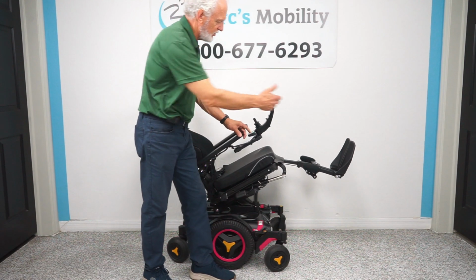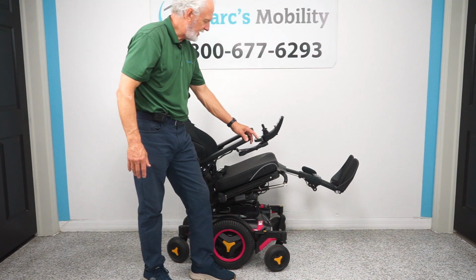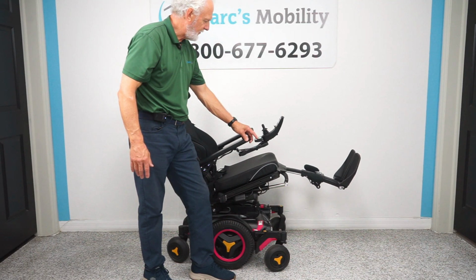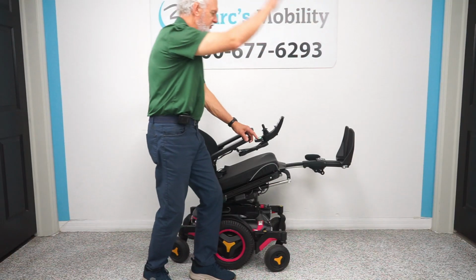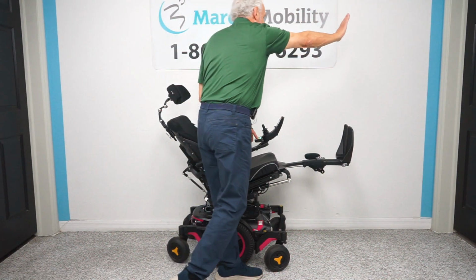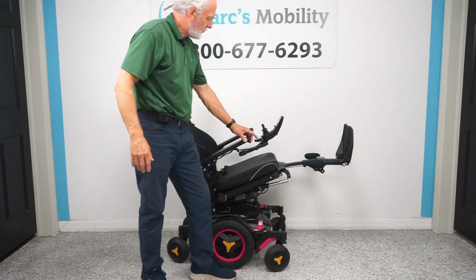Now remember, as I said, we can adjust these feet. So we're going to bring the tilt down, and I think we can get the legs to go even higher now. So as I said, if you want the feet to go way up in the air, just do it before you tilt the seat. Get your legs up and then tilt your seat. Then your legs will be right here, okay? So now we're going to bring the seat back down.